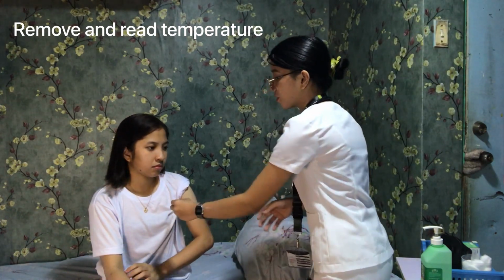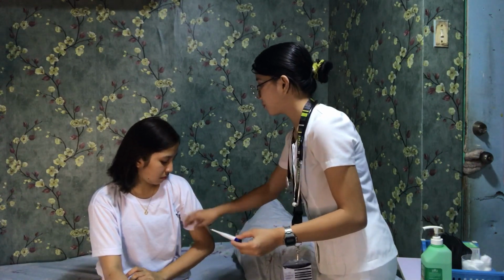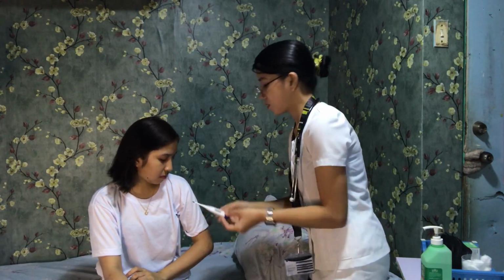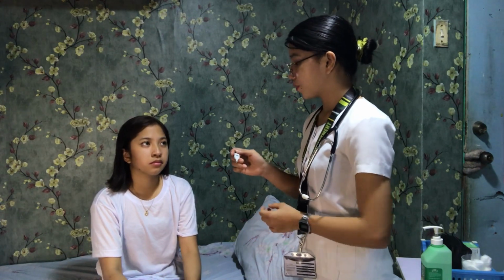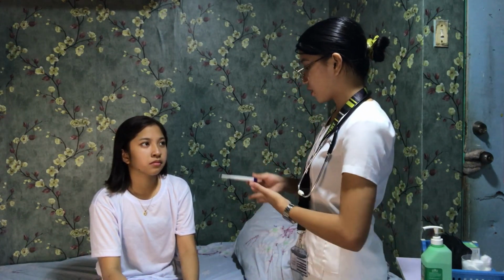The thermometer beeped. So I'm going to pull down your sleeves, ma'am. Your body temperature is 36.1 degrees Celsius, which is in the normal range.